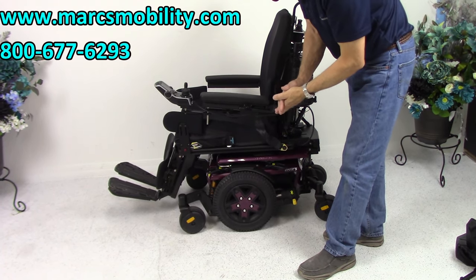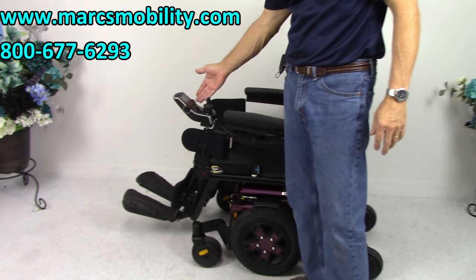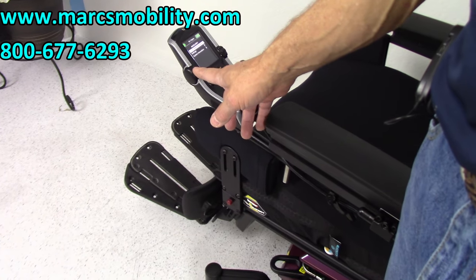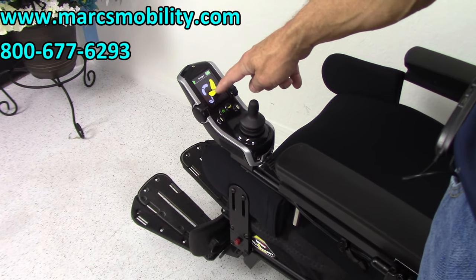On this chair, all the functions have to be worked through the joystick. So you would come to your joystick right here to work the functions, and you would hit the button on the left forward until you get to a picture of the seat. Whatever is highlighted in color is what's going to be happening.